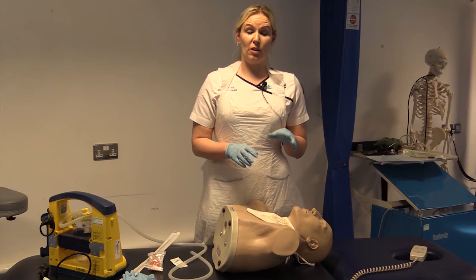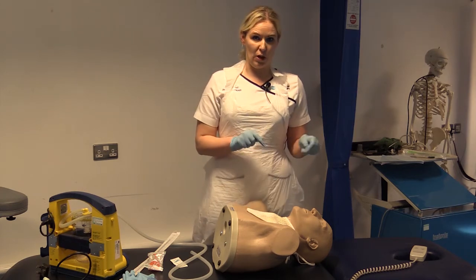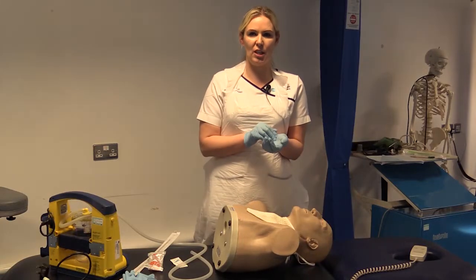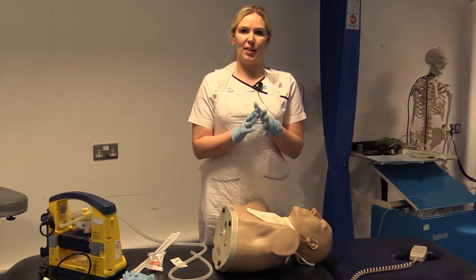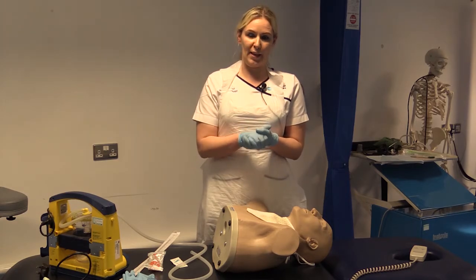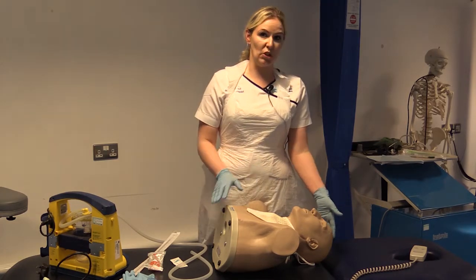This video we're looking at oropharyngeal suction via an oral airway. Okay, so again, same principles apply. You've established your need for suction, you check the patient's medical notes, and you've gained informed consent where possible. You've washed your hands and you've put on your appropriate PPE. So you're going to explain to your patient what you intend to do.